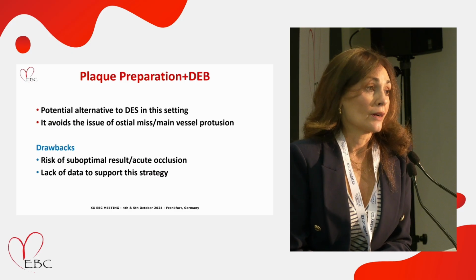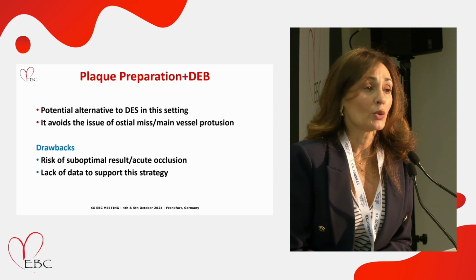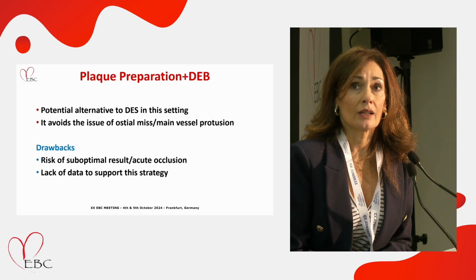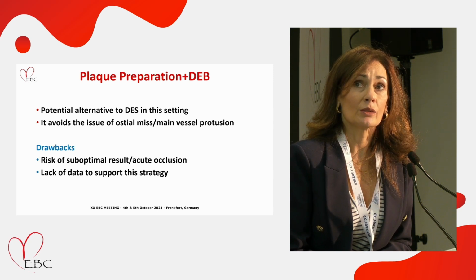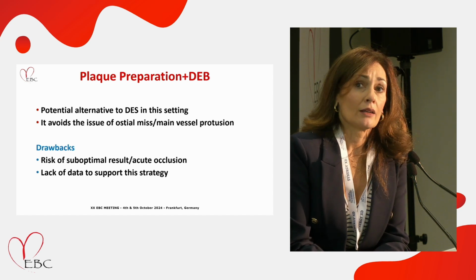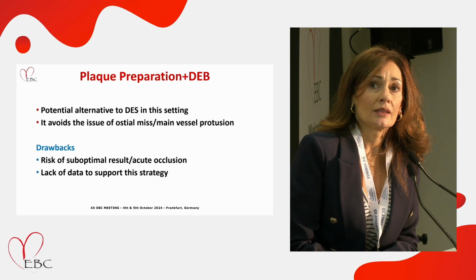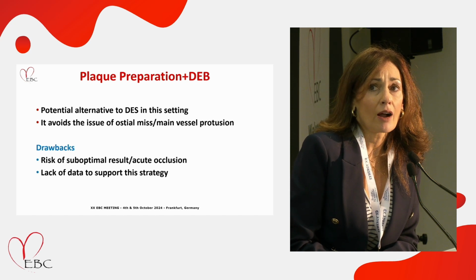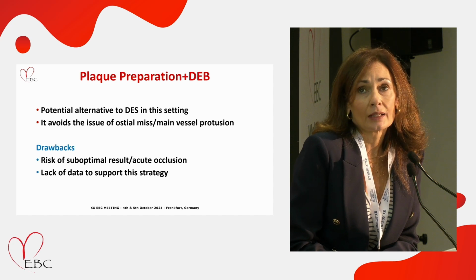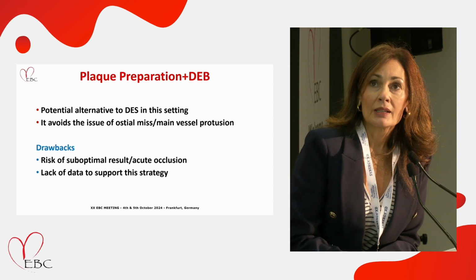Drug-eluting balloons can be a potential alternative to this in this setting. It's a very attractive technology, and it avoids the issue of ostial miss or main vessel protrusion. With this technique, there is a lack of data to support this strategy, and there is a risk of suboptimal result and acute occlusion. So, although the technique is very attractive, we need more data to support the strategy.